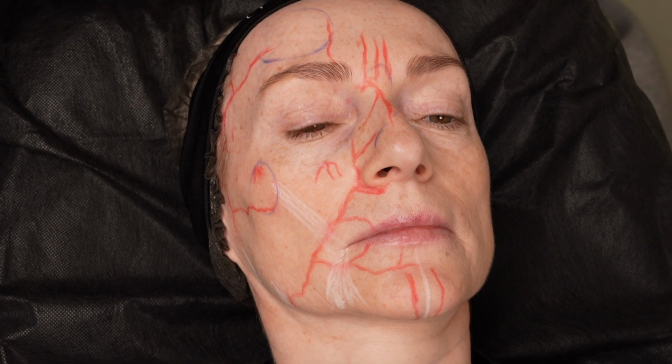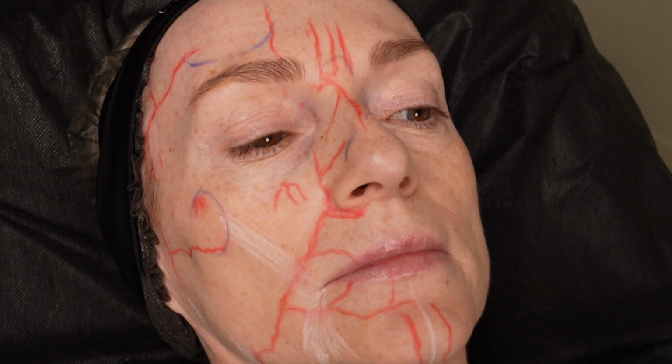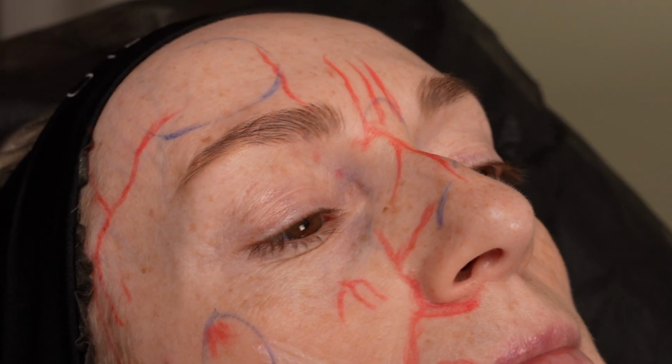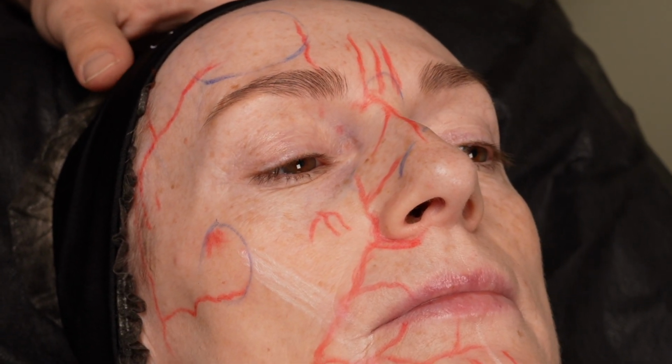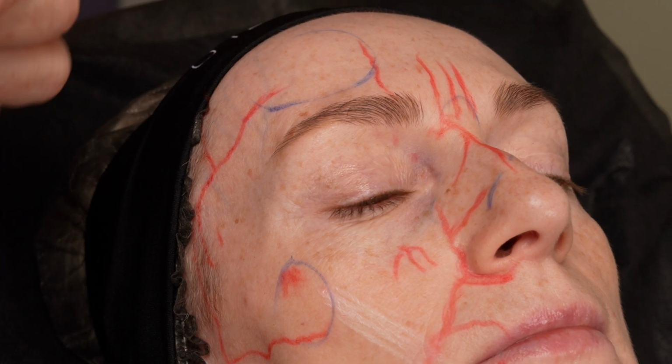Then again, if I press too much with pressure, my product from the external carotid system through the anastomosis can easily pass a backflow through the internal carotid system and can cause blindness.